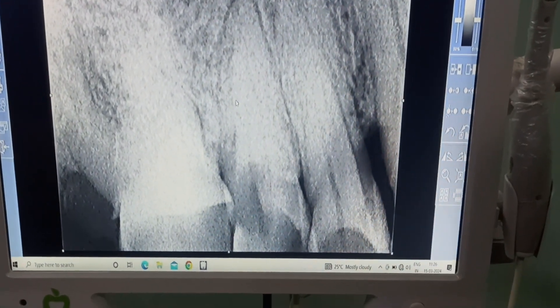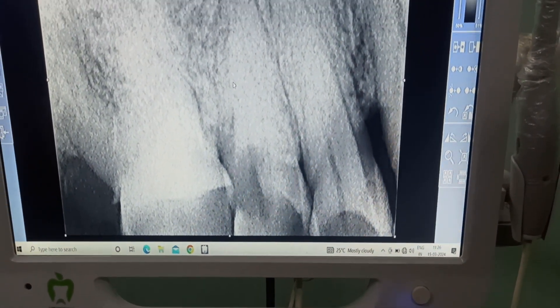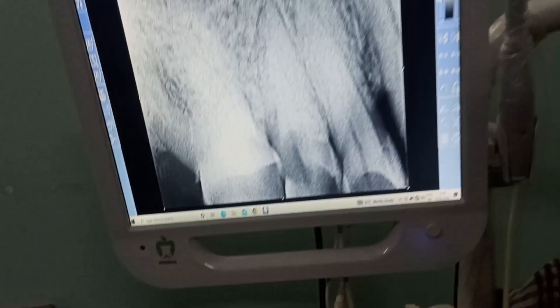Today we are going to extract this first molar tooth, first premolar.